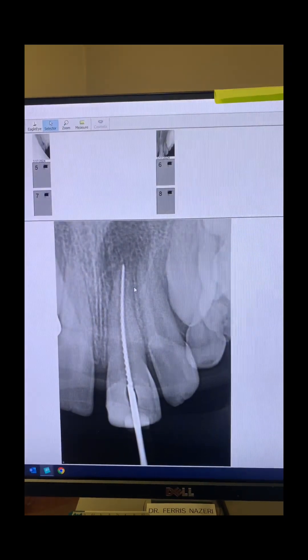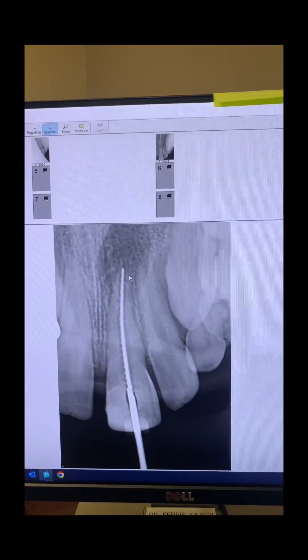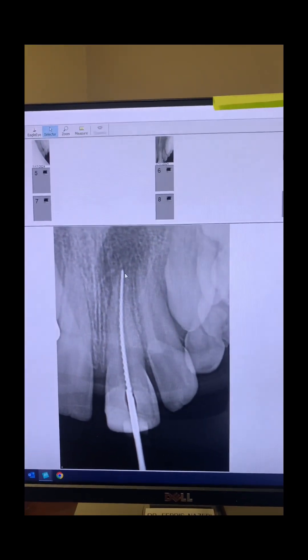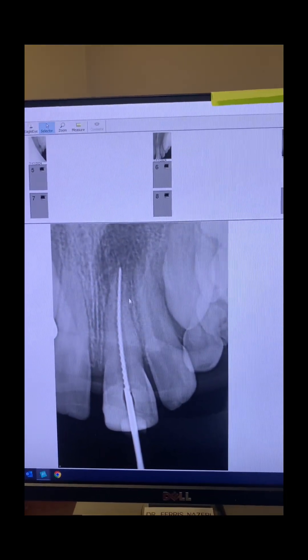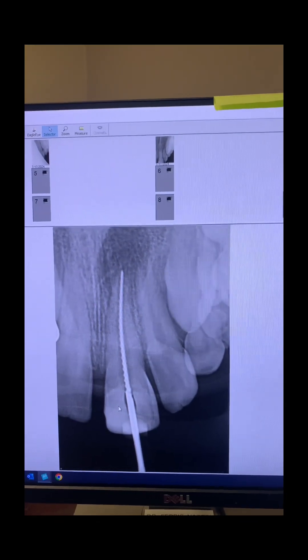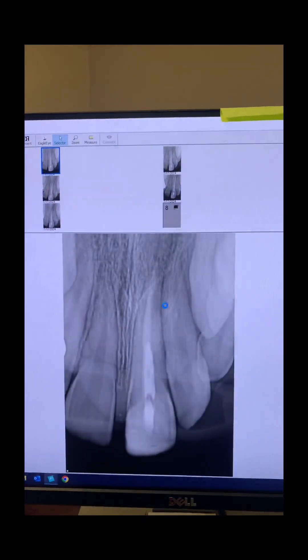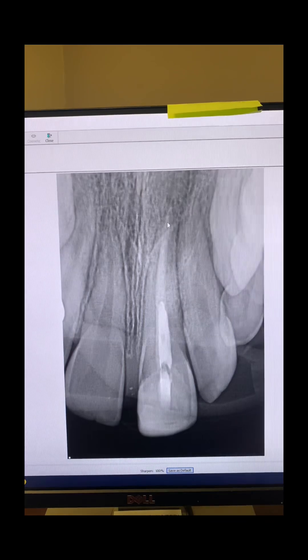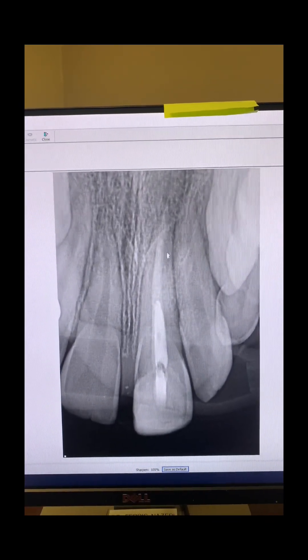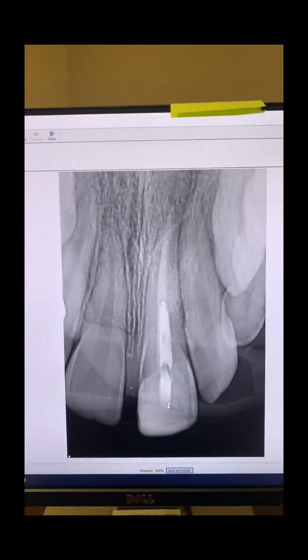I used white MTA. First, I checked to make sure there was no oozing or discharge by placing a few sterile paper points to working length and examining them — they all came out nice and dry. We went ahead and placed white MTA, as you can see right here, all the way to the apex. Apexification was done, followed by gutta-percha sealer, and the tooth was temporized.